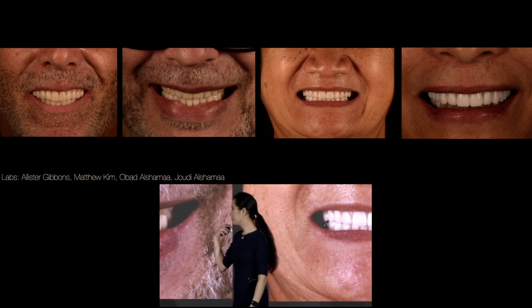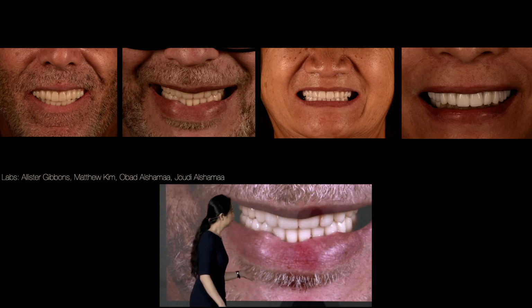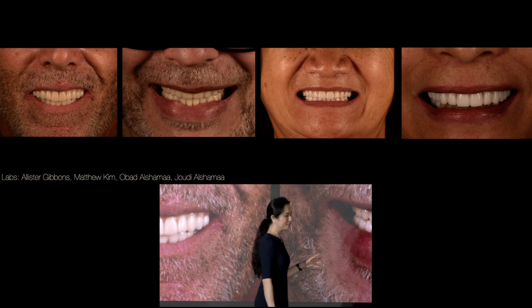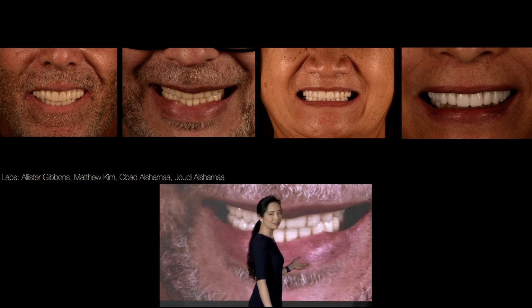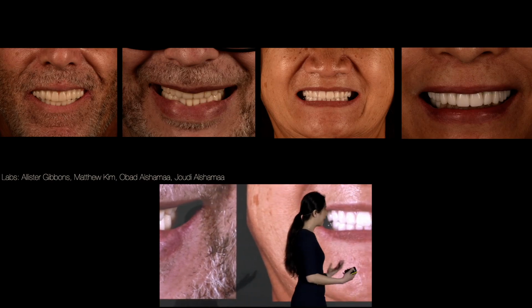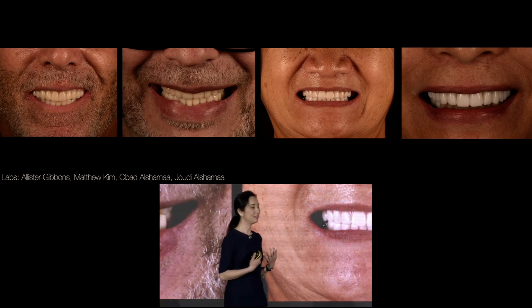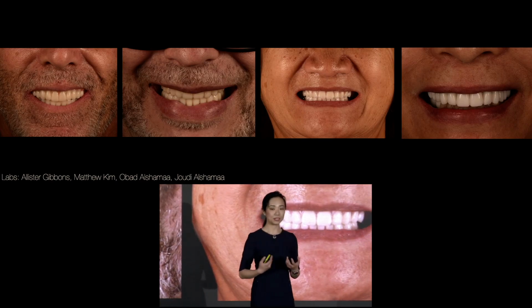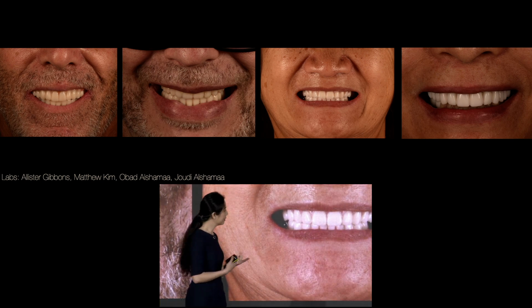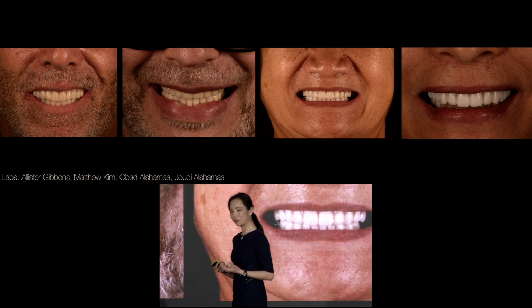So these are just a few examples from local labs, and what you'll find is that when you have a dialed-in, completely digital workflow, you can work with anyone and be able to get pretty good results. Because when everyone's using the same design software and you have the ability to evaluate the work ahead of time or make minor adjustments along the way, the adjustment times are much faster. And also, all the labs are able to do better work.